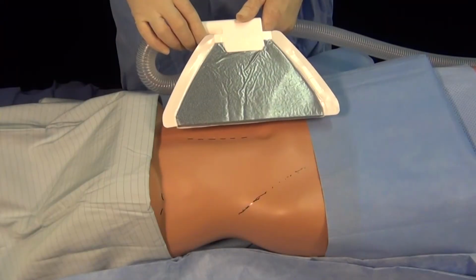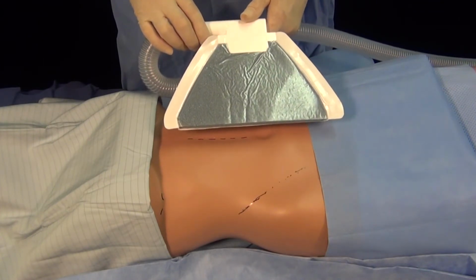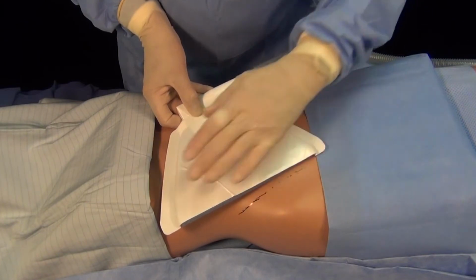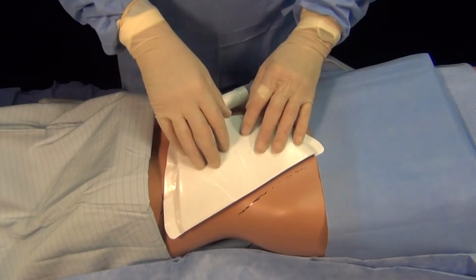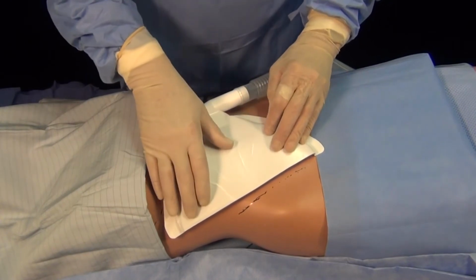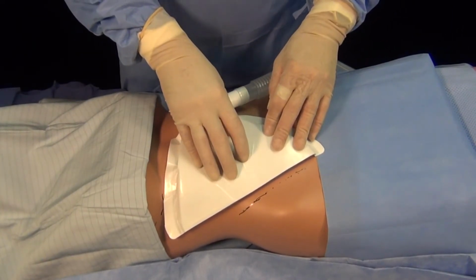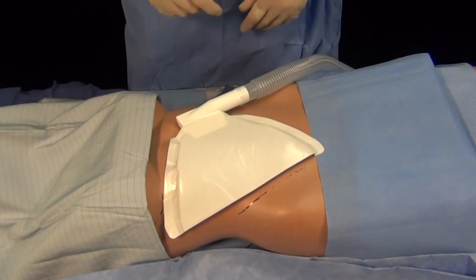The next position, we're going to assume a lateral hip incision. We've already removed the release paper, very sticky surface. And this is also placed as close to the line of incision as possible. This can also, of course, be positioned laterally if the surgeon prefers. This seems to have been, through experience, the place where it's least in the way. As a matter of fact, not in the way at all. And again, retractors can freely be used to separate the incision as the surgeon goes deeper without any problem.